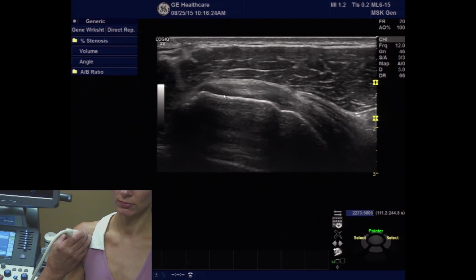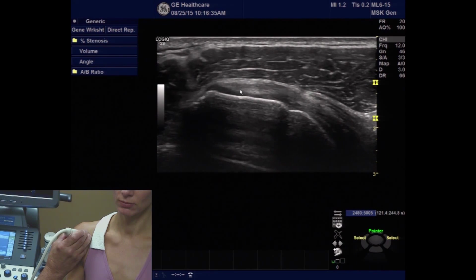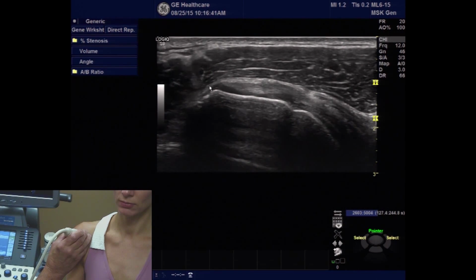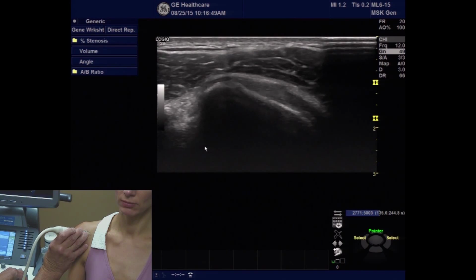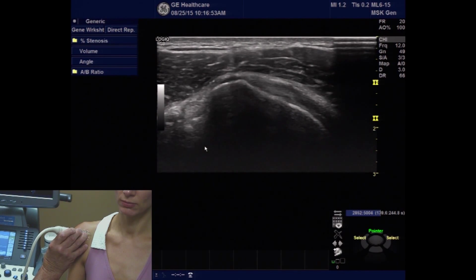Once I see this image, concern rises from what is this hypoechoic area at the distal insertion point. If we look at the angle of the beam, the beam is coming straight down, but the anatomy is sloping away. So by moving my transducer to take care of the anisotropy, I can actually make the tendon fibers become bright, and I know that this is not an actual tear.